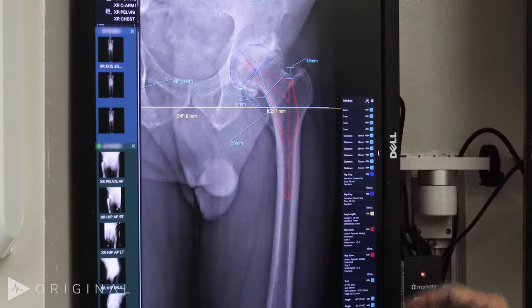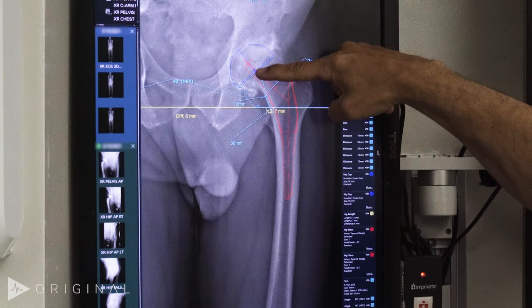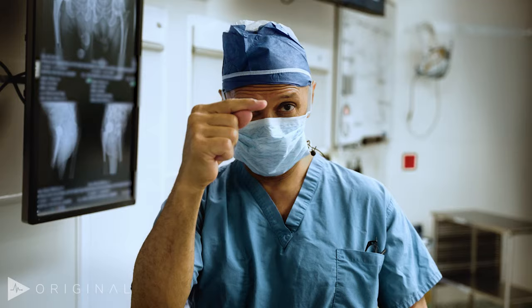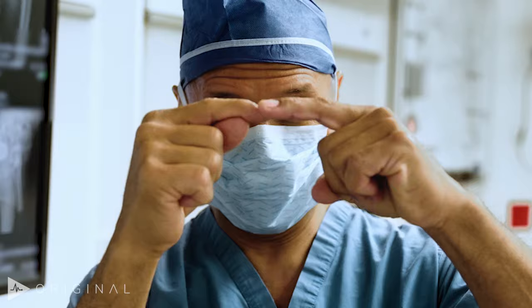We then set our position of the center of rotation of the socket and the femur relative to each other, so that if the center of rotation of the socket is here and the center of rotation of the femur is here, when they are positioned we're going to lengthen the leg by exactly that dimension.